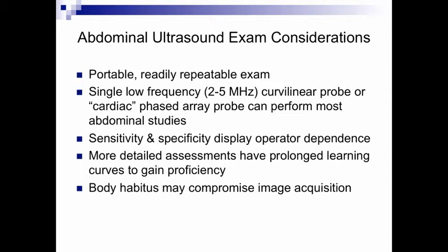Other significant confounders to the use of abdominal ultrasonography at the bedside is that patient habitus can make image acquisition particularly difficult and sometimes render the exam almost a waste of time if the habitus or bowel gas or other confounders are degrading the image quality to such an extent.